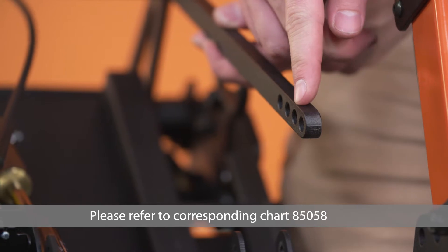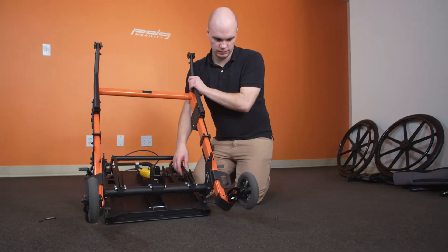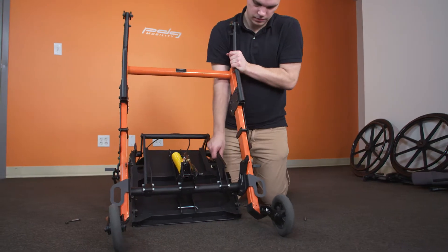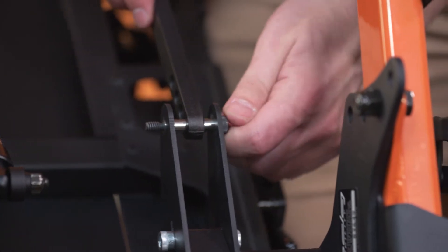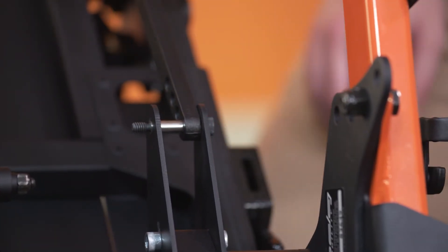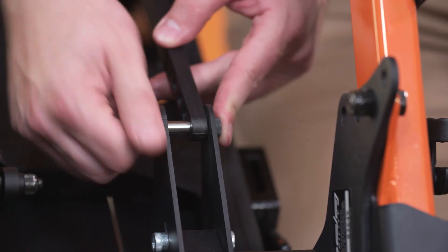Determine the desired angle for the backrest according to the setup chart. Reattach the angle adjustment fastener in the desired location, ensuring equal positioning on both sides. Reinstall lock nuts and tighten securely.